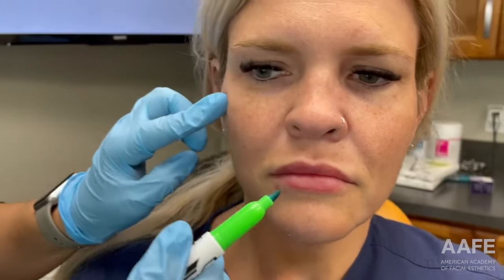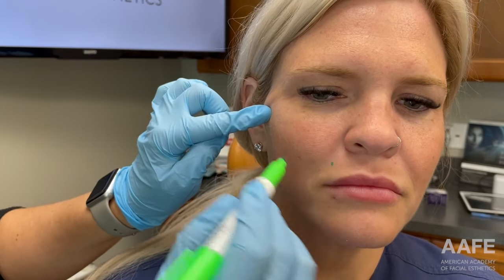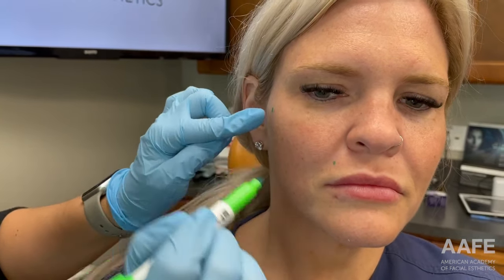Those are the areas we're going to focus on. I'm going to mark her so that you can see the process. Smile for me — relax. So if you see here, just as I gently pull back, we get a nice lift from that nasolabial fold vector.